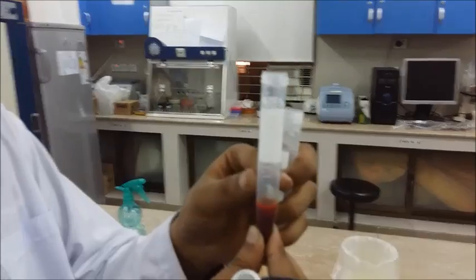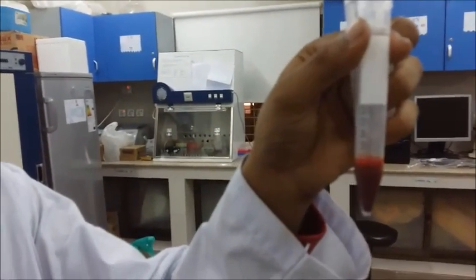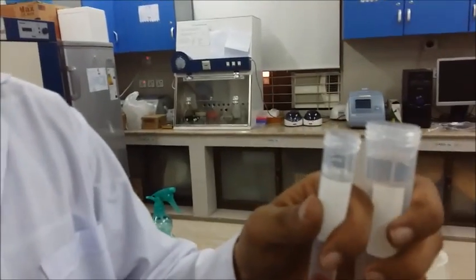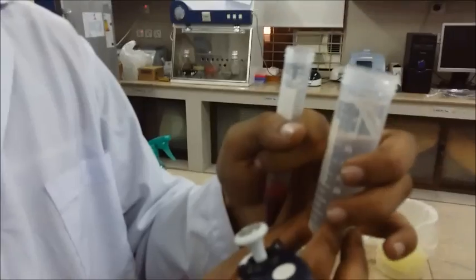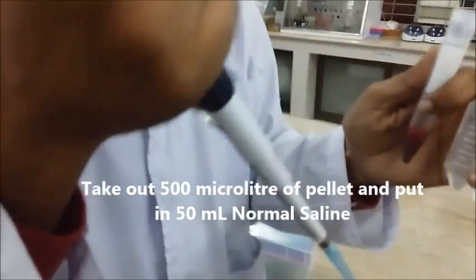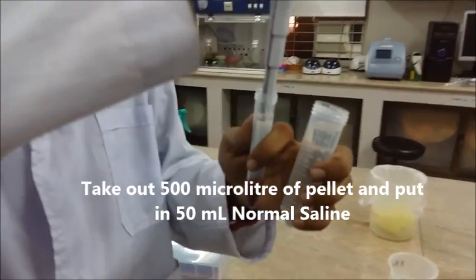After the last centrifugation, this is what the pellet looks like. We've expelled the supernatant, and now we are going to pick up 500 microliters of this pellet and introduce it to 50 ml of normal saline — and that will give us 1% washed RBCs, which you can further use in your HA or HI tests.